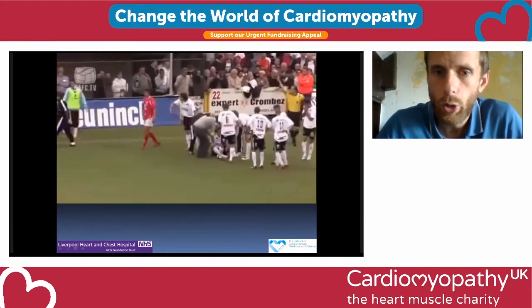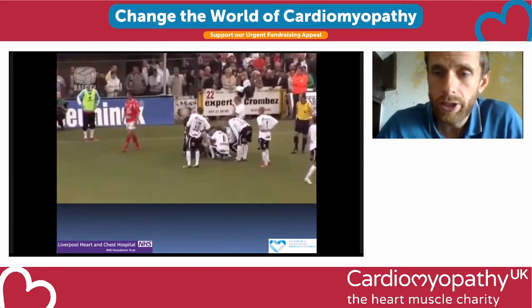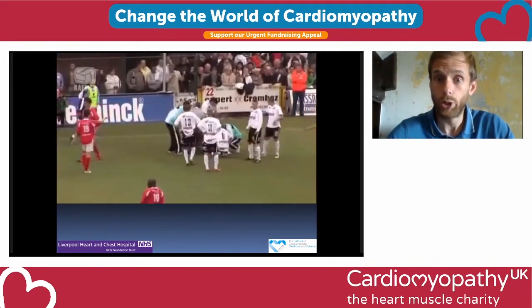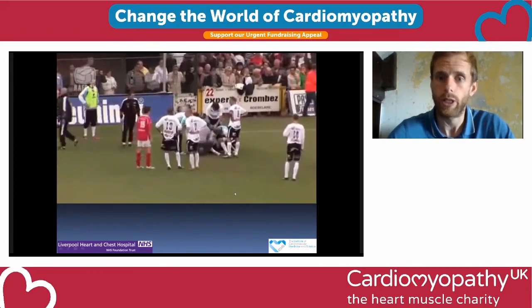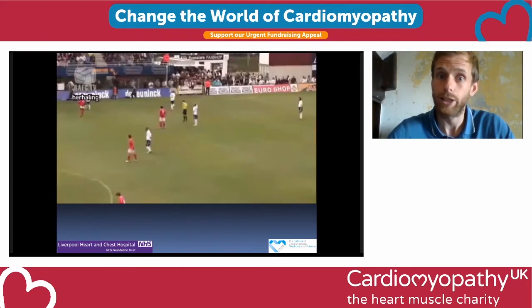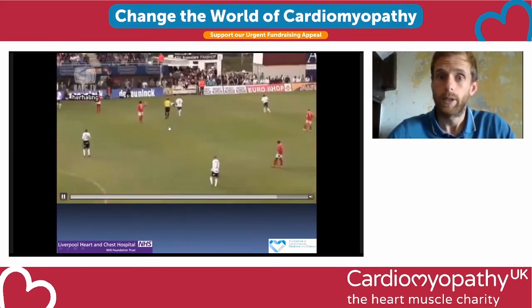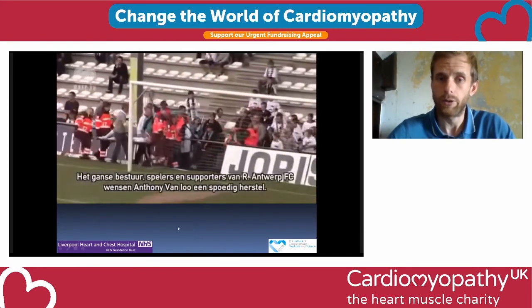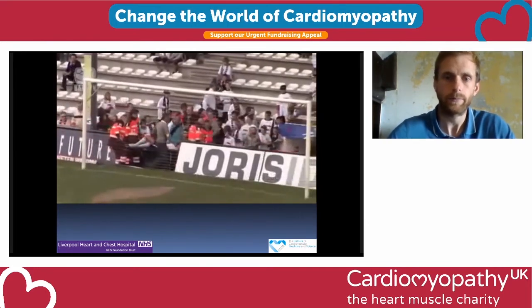So there's several take-home points from this video, which is available on YouTube if you want to hear the crowd. Firstly, the physio was there and was on him and was touching him and considering doing CPR, and the shock was delivered and he got no harm. If you have a cardiac arrest, people around you know that they can touch you. Secondly, it acted pretty quickly. And he was able to get up and sit up, and he actually wanted to play on. He was advised against it very wisely, but he felt it for himself almost immediately.